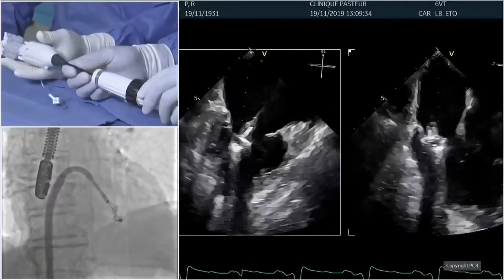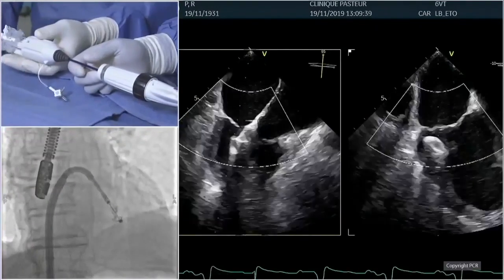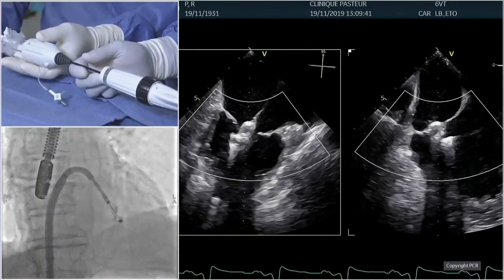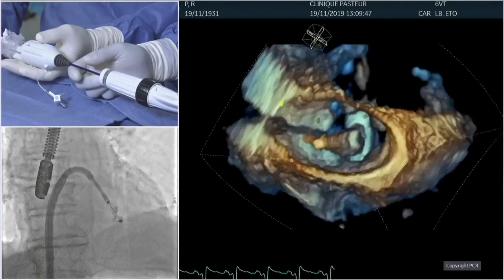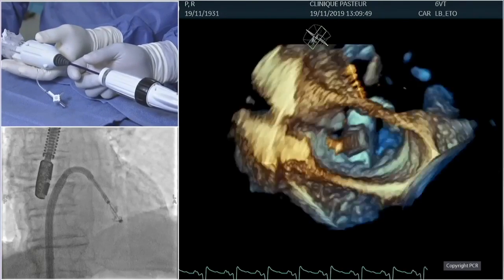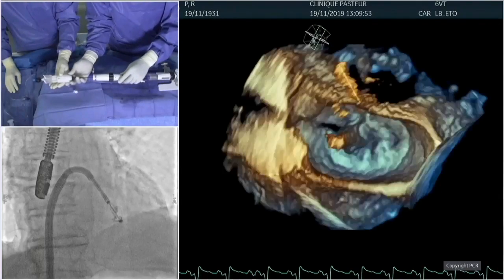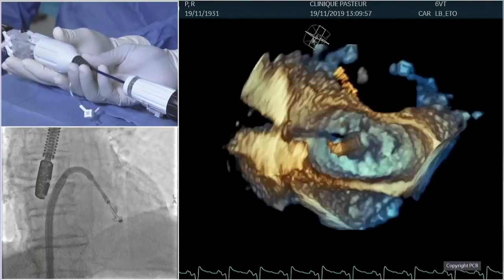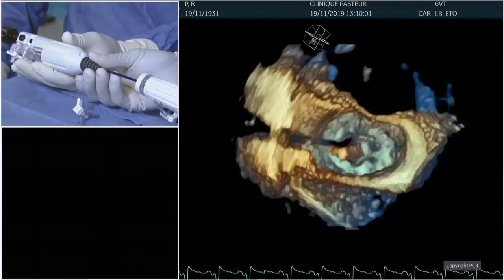And this is Philip. Hi. You might want to double check on 3D. I think now you lost the clocking. That's what we were discussing. Hearing the comment from Becky, we're going to go to 3D just to make sure that the clocking is appropriate, and that I pushed a little bit the IC just to be more lateral. So maybe the clocking a little bit more clockwise. The device is at 11 o'clock now, and you wanted to have it at 6 o'clock. You want it better now.